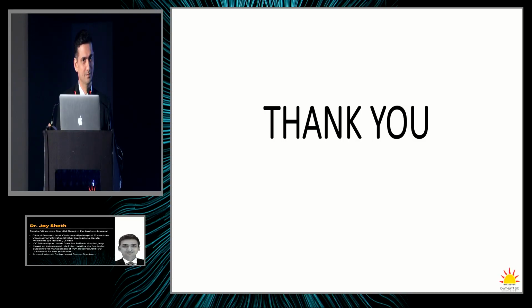So Jay, very nice summary of some of the logistics of doing the testing. One of the things we don't often talk about in meetings like this is practice efficiency. One of the reasons we like to do OCTA is it's so fast and so easy compared to fluorescein. In my practice, the OCTs get done before the patients see me. What I struggle to do, and I'm continually trying to do, is educate my techs on when I truly want an OCTA so that I don't have to see the patient back a second time. And I think getting protocols like that set up in your practice can help you immensely to get through your day in a very efficient manner.